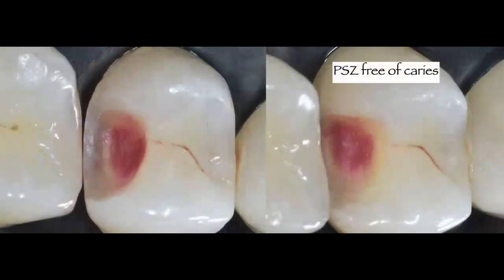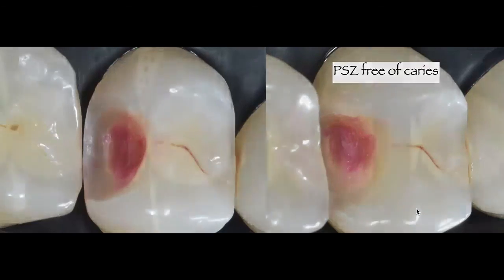And the idea of point B, again, is to have that peripheral seal zone caries free, meaning that you have that very nice and clean dentin, 1 to 2 millimeters within the DEJ, and just leaving caries in the deeper areas, and if at all possible, eliminating all that denatured collagen and just leaving some affected dentin there that would again stain pink, as you are seeing in this photo.